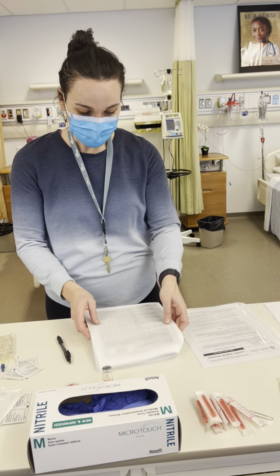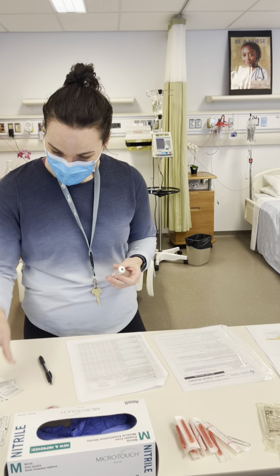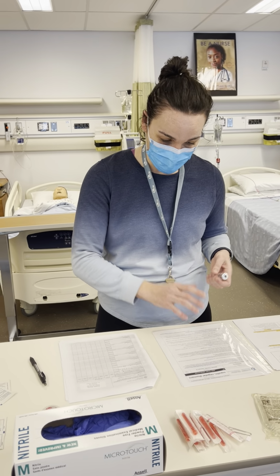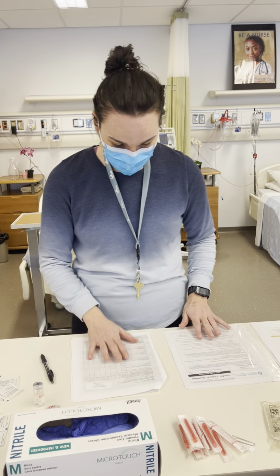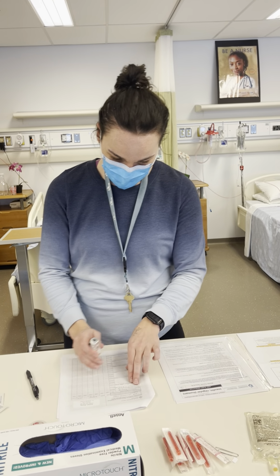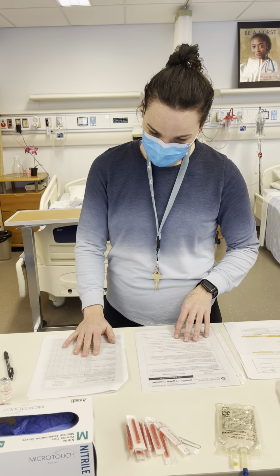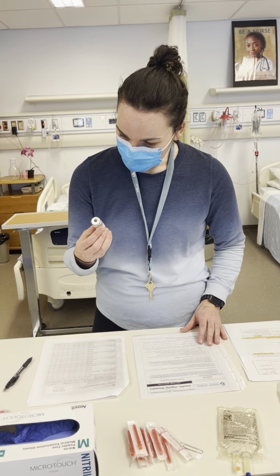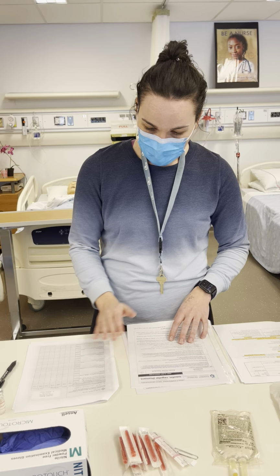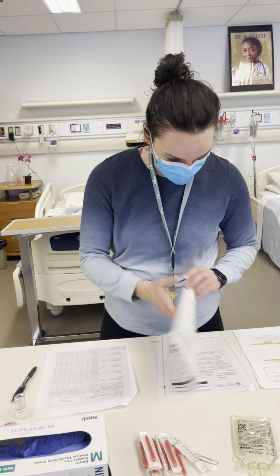So then we're going to grab our vial, and we're going to compare our vial, and we'll also grab our PDM. So we've got insulin Humulin R for our PDM, that's what's ordered, insulin Humulin R, and that's what's in our vial. So that all matches up. This is 100 units per milliliter. So we'll go over to our PDM and Humulin R, everything's right.